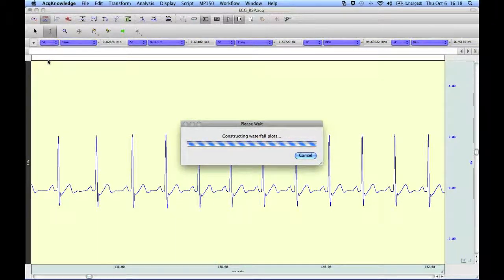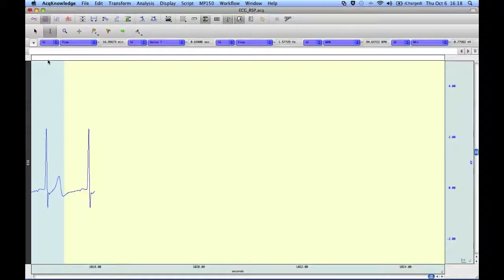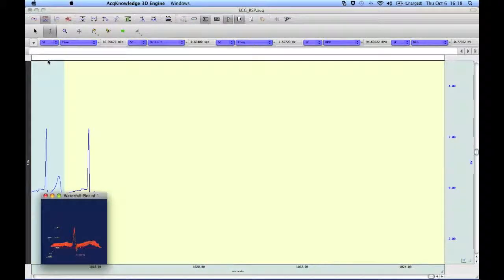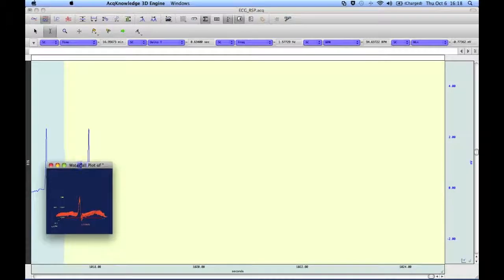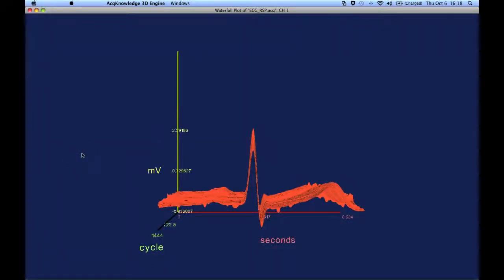This will take a few seconds while the software goes through and analyzes everything, and here, if I maximize this, here we have our waterfall plot.